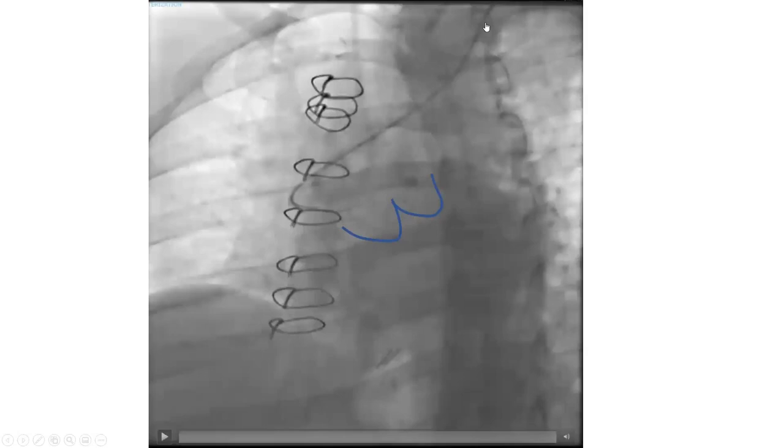Here's a case from left radial. Some people think left radial is easier than right radial, but I think they are both the same in terms of difficulty, especially since we're more experienced going from right radial. This is a patient with a short ascending aorta and a really sharp angle between the left subclavian, arch, and ascending aorta. We were able to get the catheter and wire down, but again we fall onto the right cusp. The key is to jump from right to left cusp — that's always a difficult step in those difficult cases. You want to jump from right to left to eventually loop it from the left cusp onto the coronary from below.